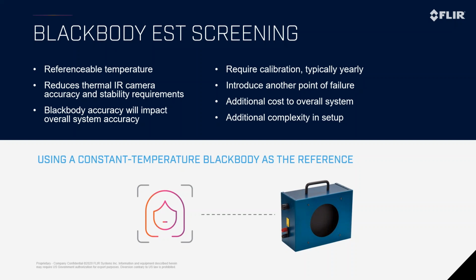So every minute or so, if you've held one of our cameras, you maybe hear it click when you have it on, right? It sounds like a camera shuttering. What that's doing is our NUC, our non-uniform correction test. So the shutter's in front of the camera, and the lens says, okay, I see this thing pop down really quick, just like a blink of an eye. And it says, okay, this is 70 degrees. It's supposed to be 70 degrees.